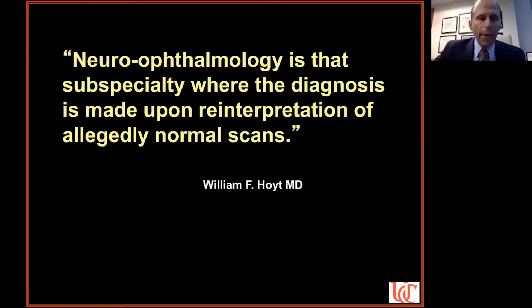One of our fathers of neuro-ophthalmology in the United States is Bill Hoyt, and Bill Hoyt said this about neuro-ophthalmology. Neuro-ophthalmology is that subspecialty where the diagnosis is made upon reinterpretation of allegedly normal scans. I think this is certainly true, and I routinely look at MRIs or CT scans that were read as normal and actually are not normal. I will show you some examples of that as we go through the webinar today.